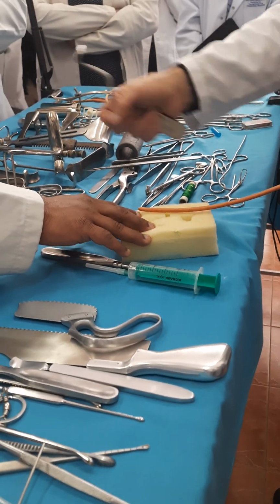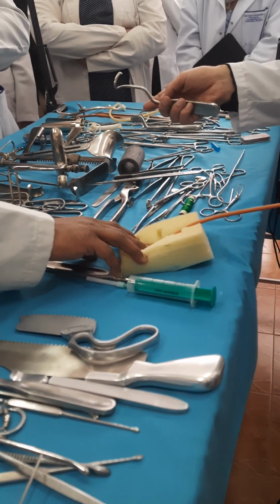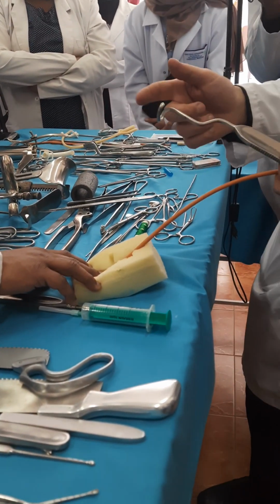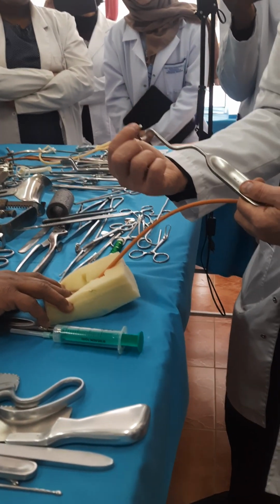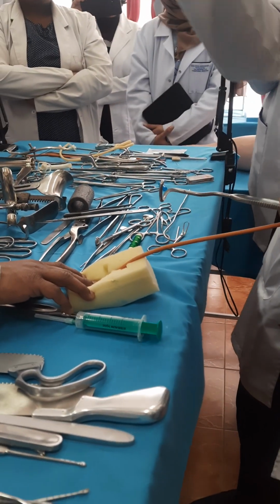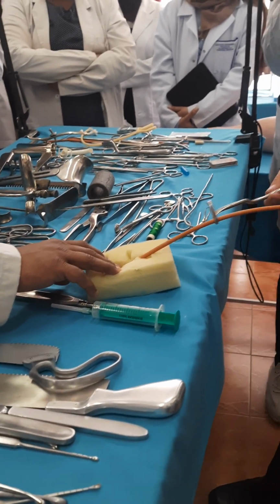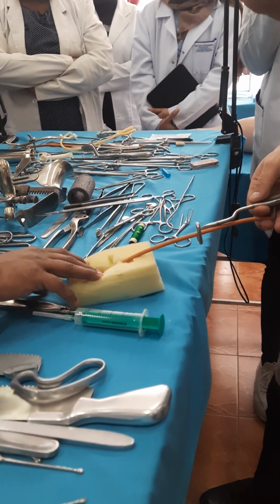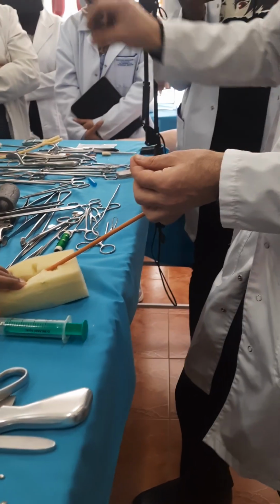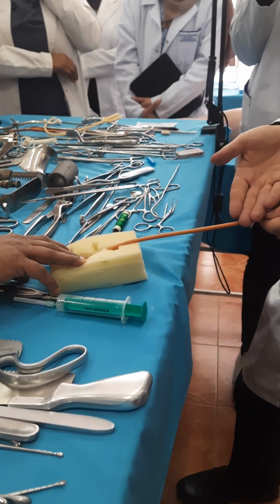I don't have it. I lose it. That's why these instruments, guys, are not souvenirs. Don't take it, please. It absolutely resembles this instrument, but it has a hole. We call it a ligature needle. We take the thread, I put the picture, you can see. We insert the thread inside the eye, then in a hook shape form, we turn it, surround the vessel, we take the ligature. In opposite movement, we remove it, and we ligate the vessel outside of the wound.